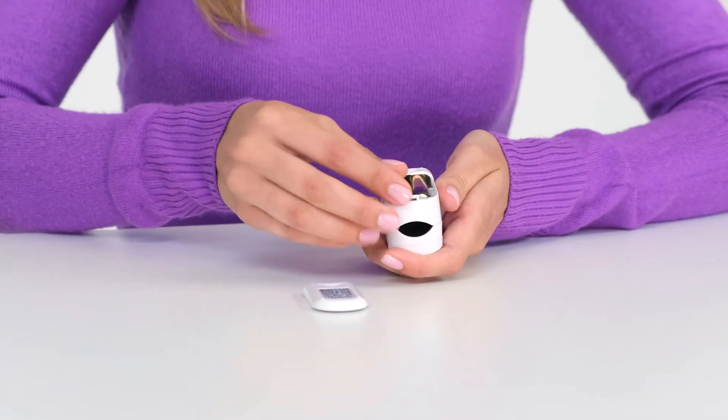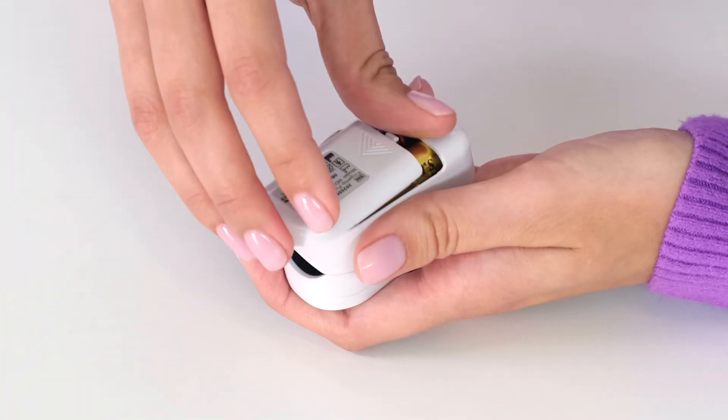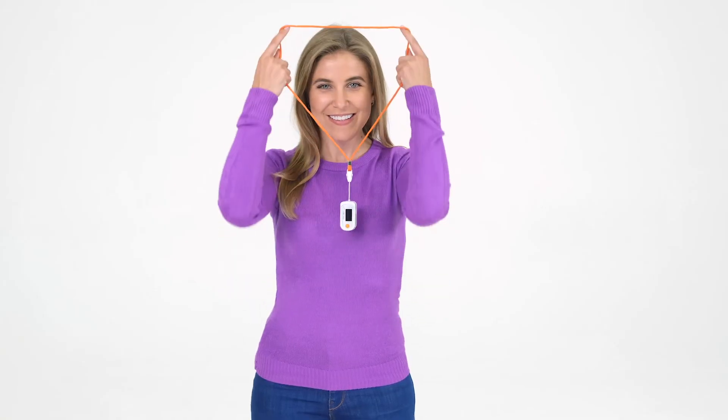The device operates in standalone mode from two AAA batteries. A lanyard is provided for easy wearing.